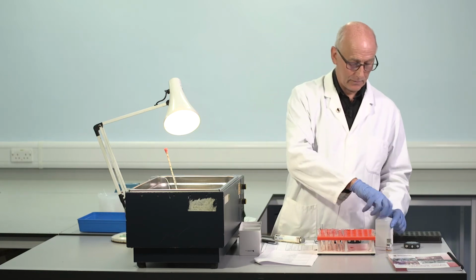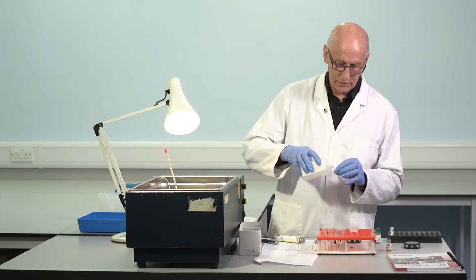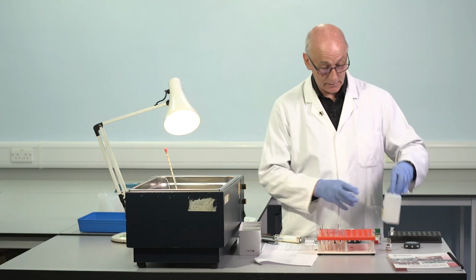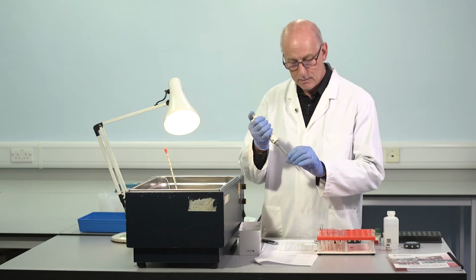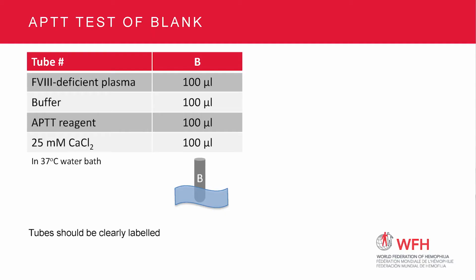So I need the same buffer we've been using to construct dilutions, and this is added to the factor VIII deficient plasma, 100 microlitres. So it's in place of the dilution. No factor VIII in the buffer, of course. So there's just deficient plasma and buffer. This is warmed, and then we treat it in the same way as we did the dilutions of test, standard, QC, and so on. Coming up to temperature.